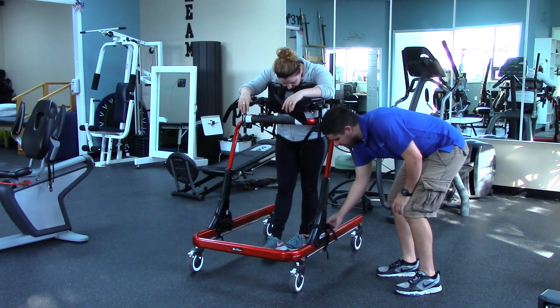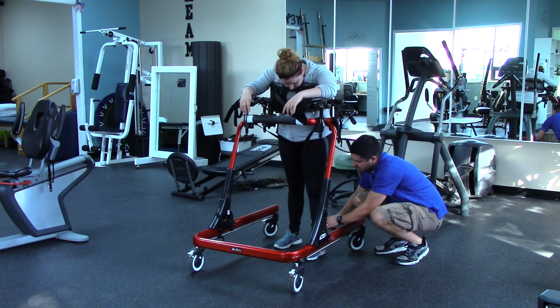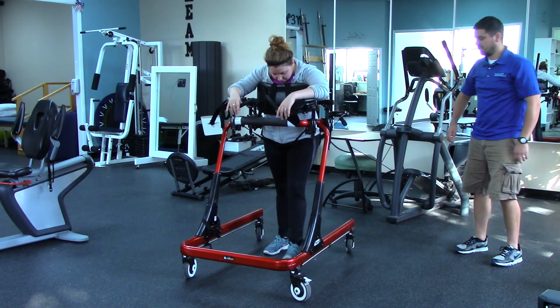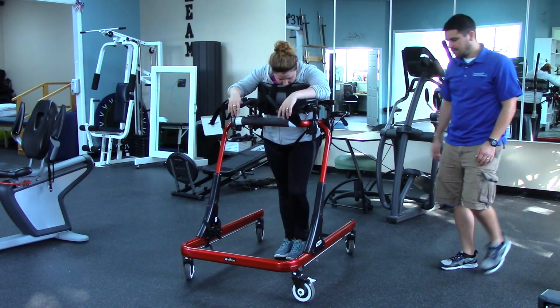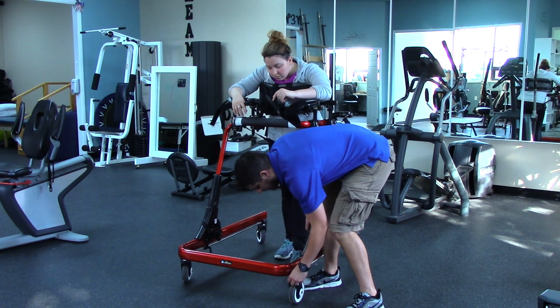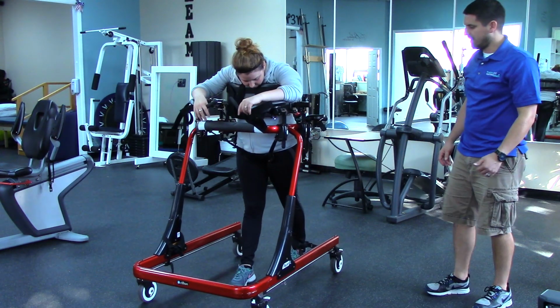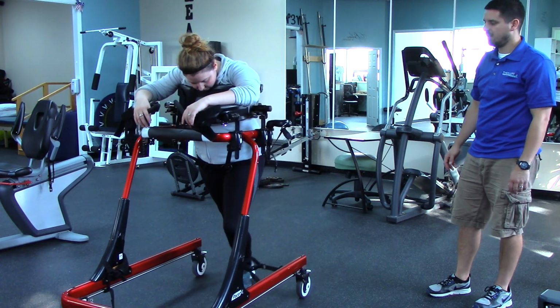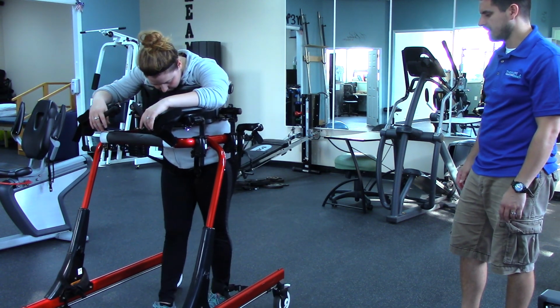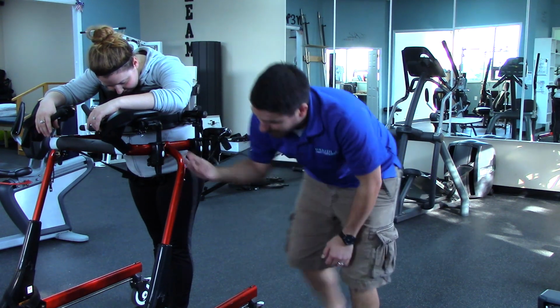So if someone's scissoring, we can also put these guys on. It's going to prevent them from being able to pull their legs too close together. It still gives them the ability to flex and extend. And then lastly, we have the directional locks that we can apply to keep them only going one direction, like straight. So this is for when maybe they have left side hemiplegia, they're pushing off on the right and they're constantly falling to the left. We're going to try to take that out of the equation, the ability to stabilize on the leg. So now they're only able to walk forward, progress the unit forward. And they can't go backwards now, so that really makes it.